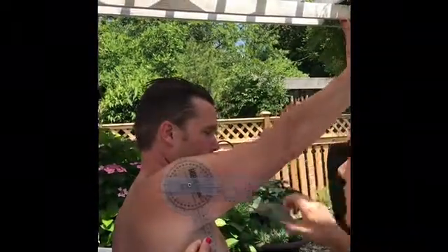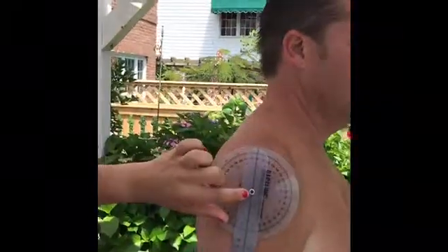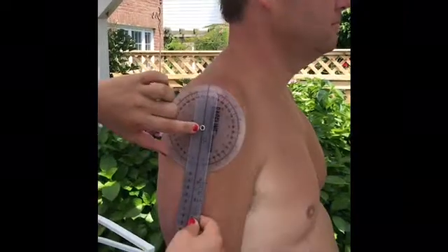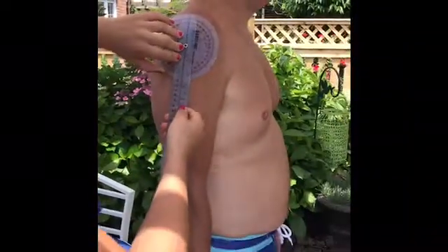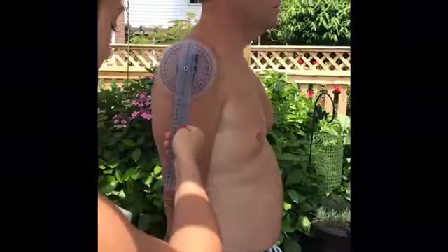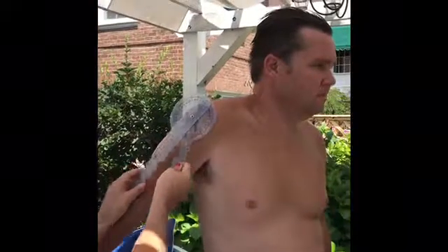75. All right, now we're going to be doing shoulder extension. The axis is going to be on the lateral surface of the acromion process. The stable arm is going to be mid-trunk, and the moving arm is going to be midline of the humerus. Typical range of motion is 0 to 50 degrees. So go ahead and bring your arm back as far back as you can go. And it is 45 degrees.